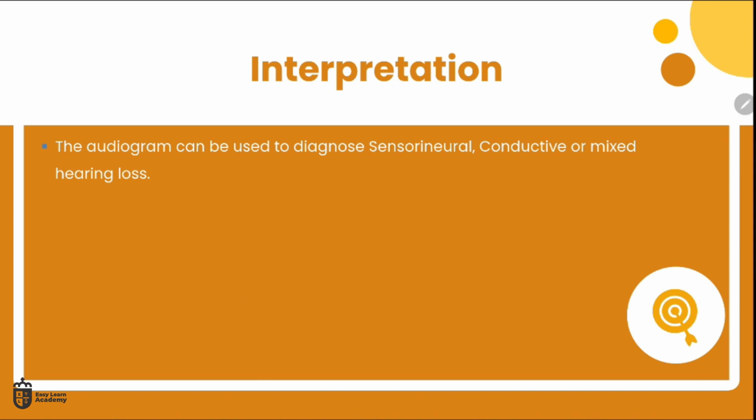And now we're just going to establish the first 4 points. So rather than just move away from this slide, I'll just write on the screen. I'll try not to make it too messy, but so that we are not moving away, I think it may be easier. So the first thing you need to understand for the audiogram, point 1, is what we call the 20 decibel mark.